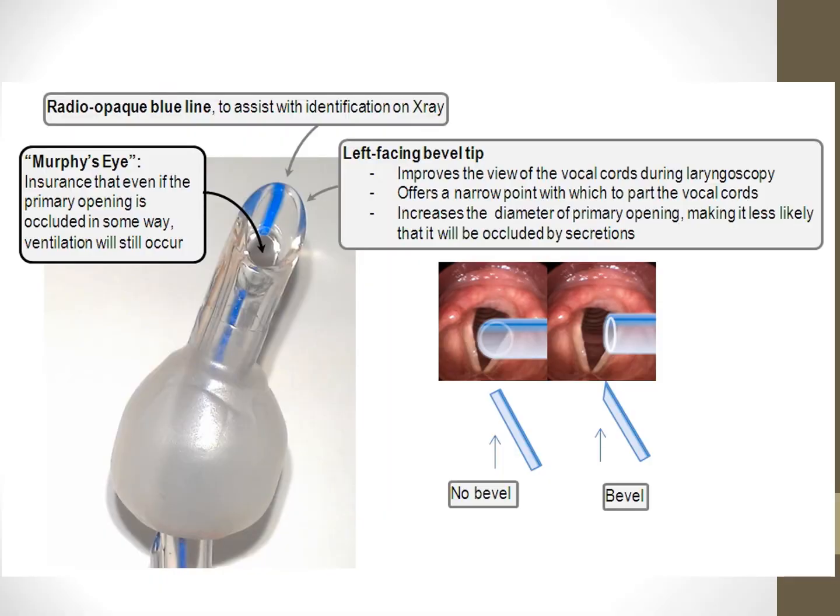Okay. So the radiopaque line, this is perfect. We want a radiopaque line. This is something we see on intubation. After we get an intubation, we want to get an x-ray to verify placement, hopefully about 1 to 3 centimeters above the carina. So when we see it, that radiopaque line helps us see on x-ray how far above the carina we are. We don't want it too high because then we know we're up against the vocal cords.